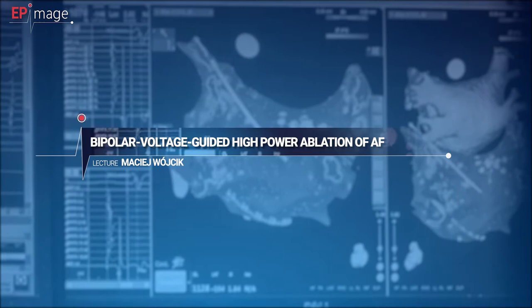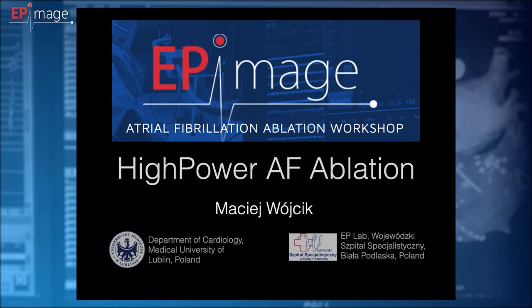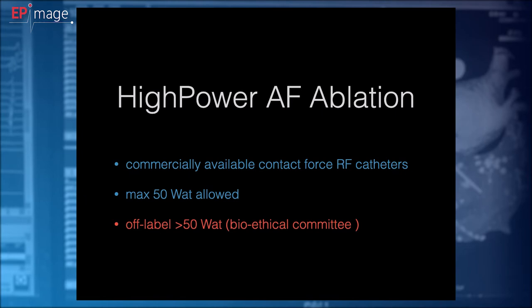Welcome to EP Image 2021. I'm Maciej Wójcik, electrophysiologist from Poland. Let me say a few words about high power ablation in patients with atrial fibrillation. We'll focus on high power ablation with commercially available contact force catheters, which allowed us to use 50 watts. If you go beyond this limit, you will be off label and probably you will need agreement of your local medical committee.